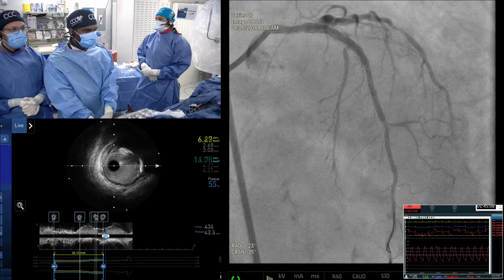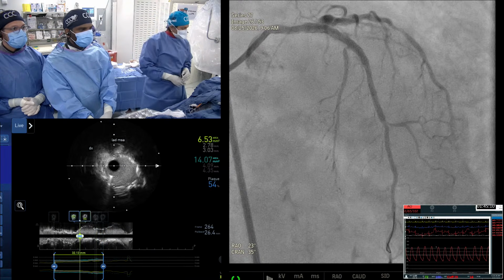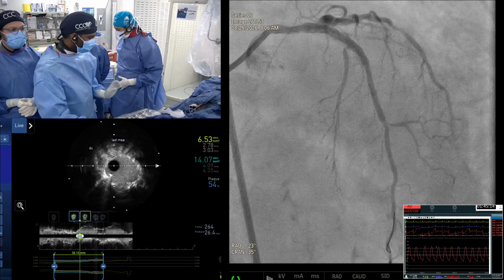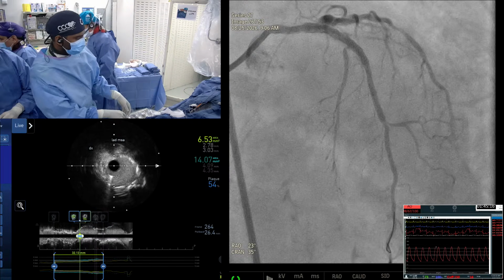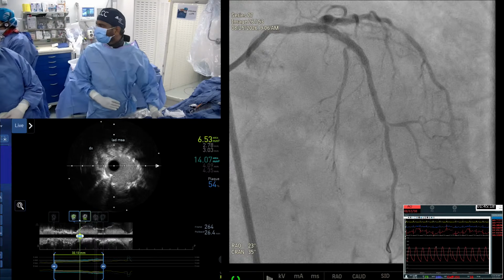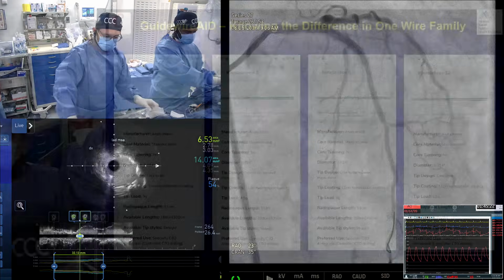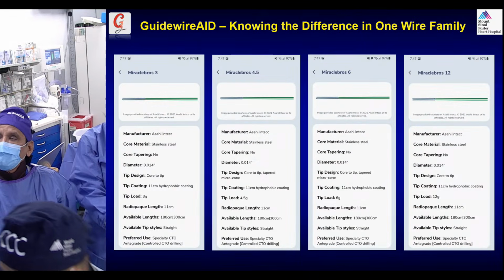It's not a very big vessel, it's diffusely diseased, and do we give anything more or no? Not yet. Closure after going through is also very important. So at least we have the flow, even TIMI 1 flow, and this eliminated those EKG changes. It's TIMI 2.5 flow, but there is disease in the diagonal, but I think we are okay.